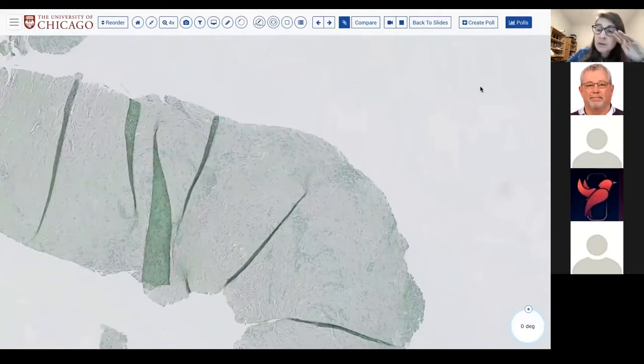So if you aren't certain if something is glycogen or mucin, and you have staining with the PAS, and it completely goes away on the diastase, then you really know you're dealing with a glycogen type of substance, in a squamous cell carcinoma, for example. So I tend to like the PAS diastase. Our stain works very cleanly and strongly, and again, it'll help you with the diagnosis of glycogen as well.